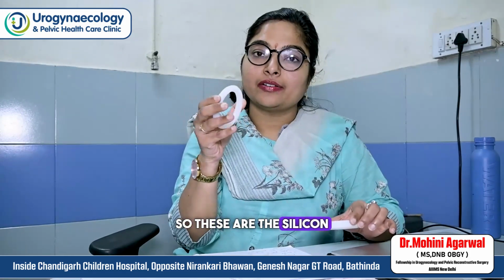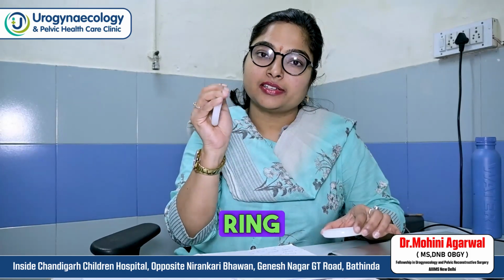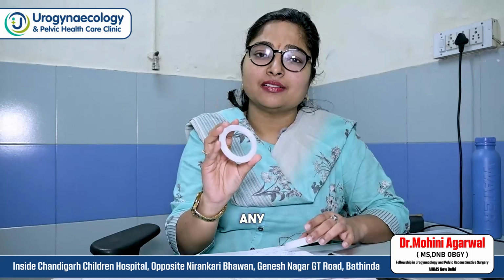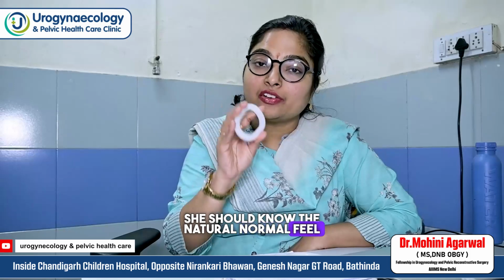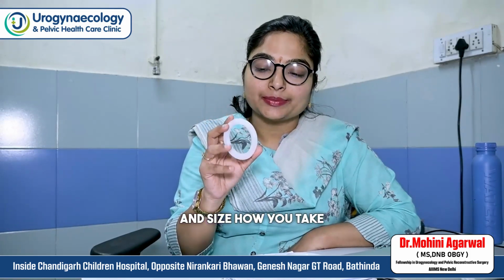So these are the silicone ring pessaries. See the softness. You don't have to use rubber or latex pessaries; we don't use them nowadays. These are silicone, non-allergic. It does not absorb any fluid or discharge, so it does not give any bad odor to the vagina. You make the patient feel it, because this should be the consistency in the follow-up also. When you teach self-care to the patient on how to remove it, she should know the normal feel of the pessary.